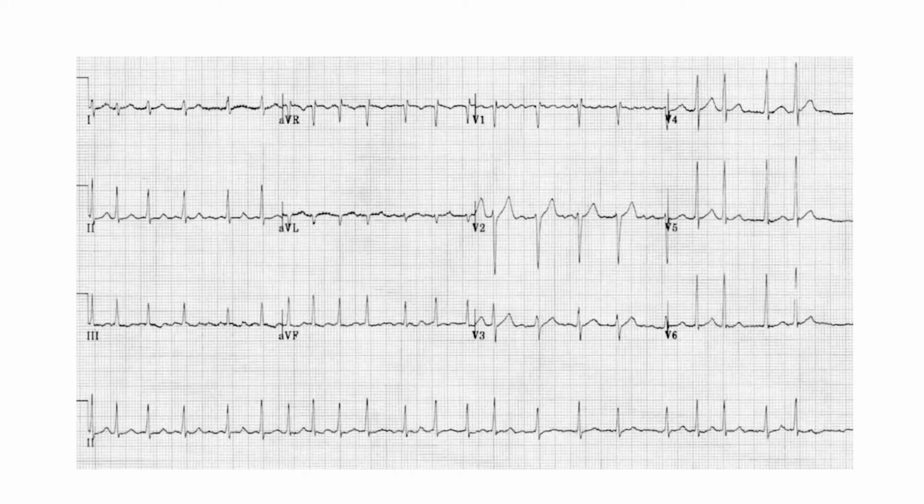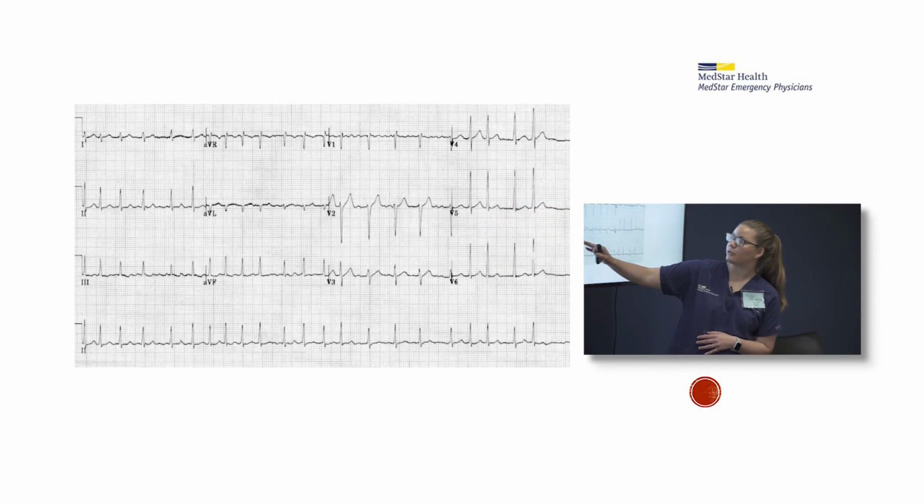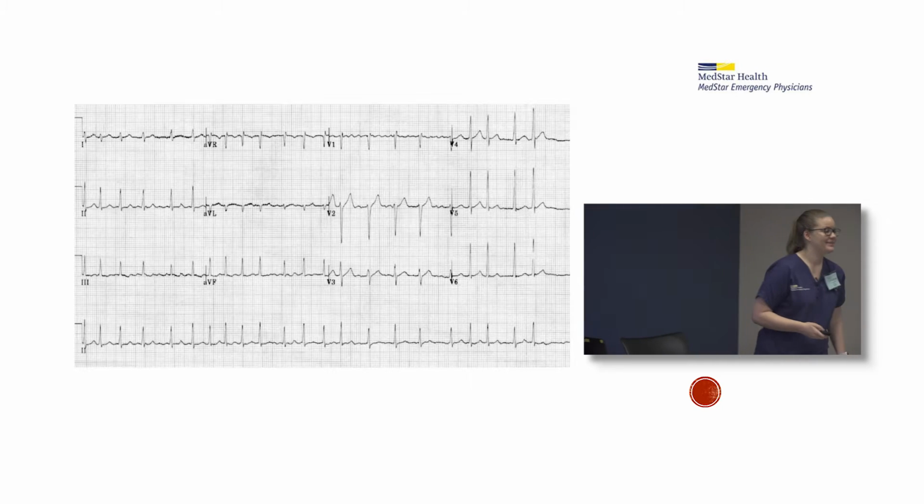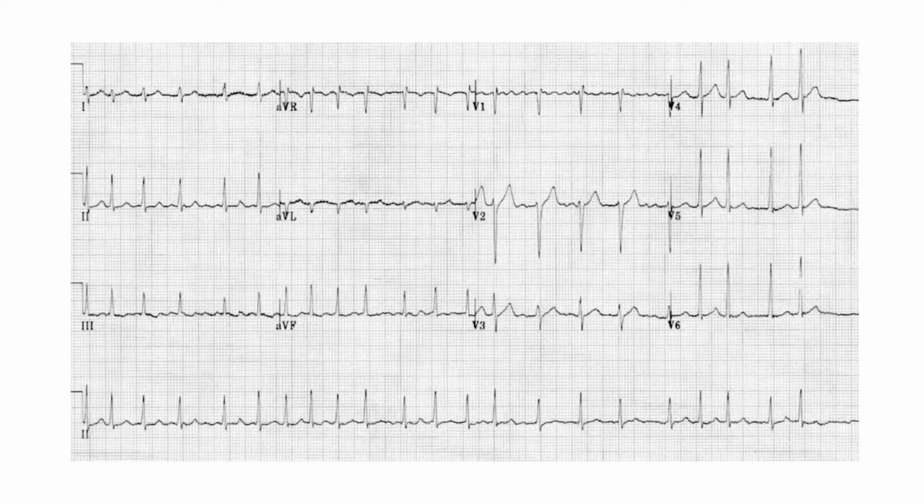All right, it's a little bit of an abnormal morphology in V2. The segment itself, I would say, probably looks okay. You probably have some inversions here, but I don't know that the whole segment is down. This one's a little bit hard to see. Perfect, excellent. Okay, next up.